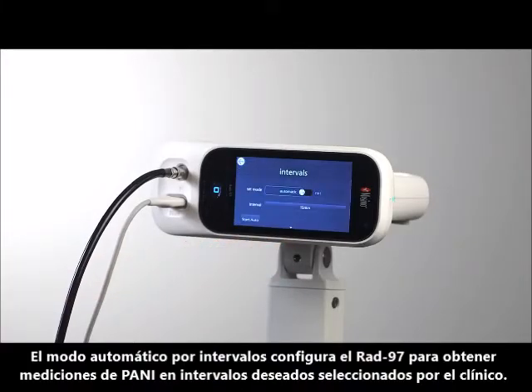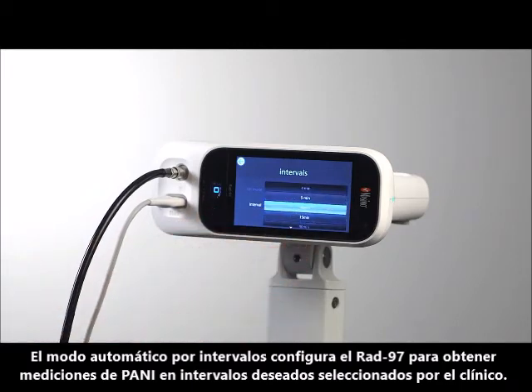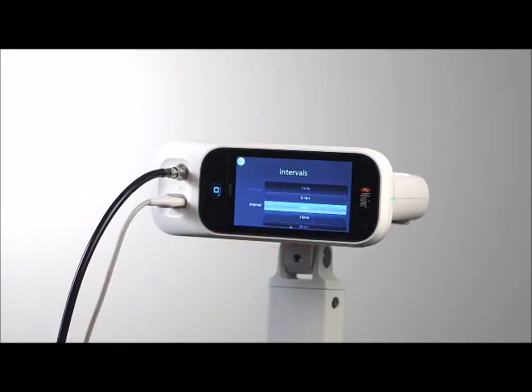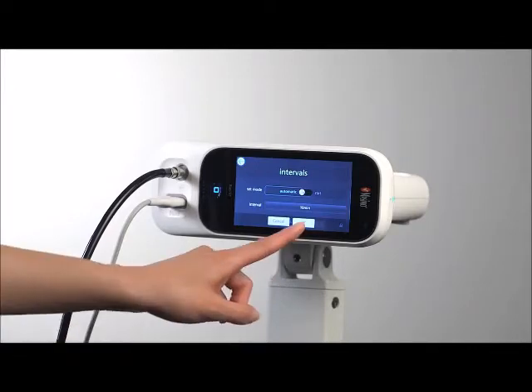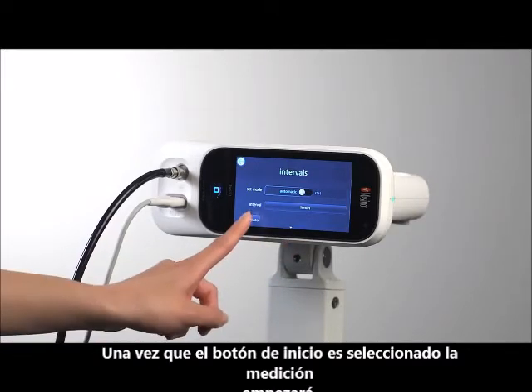Automatic Interval mode sets RAD97 to obtain NIBP measurements every desired interval, as selected by the clinician. Once Start Auto is selected, measurements will begin.